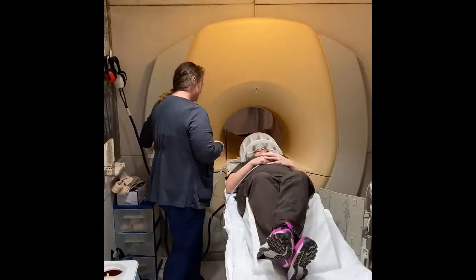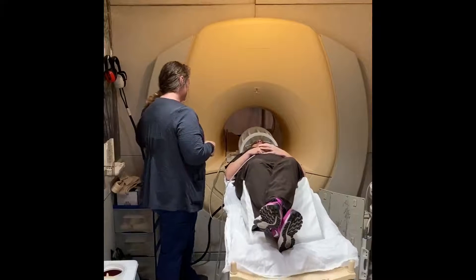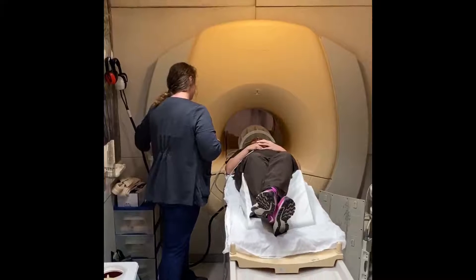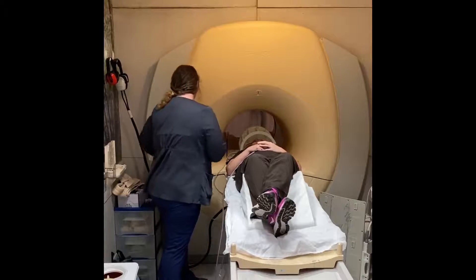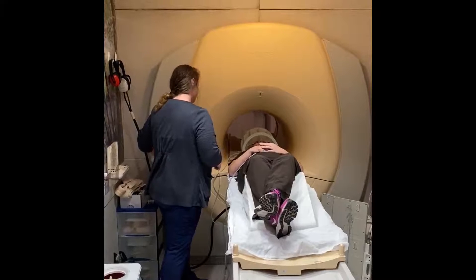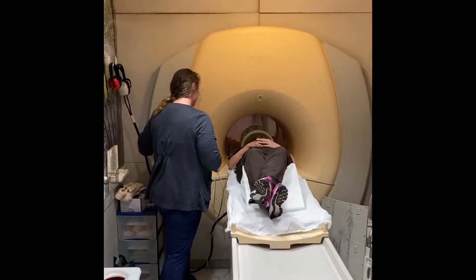Once you are set in the proper position the MRI table slides into the bore of the magnet where the head will be in the center of the machine. You will lay like this for close to 30 minutes.